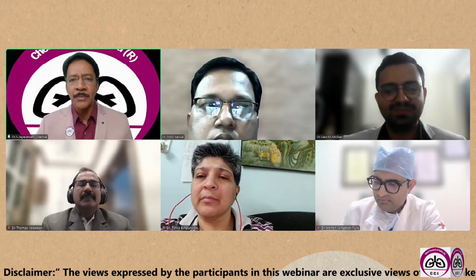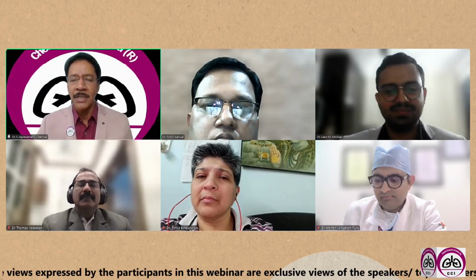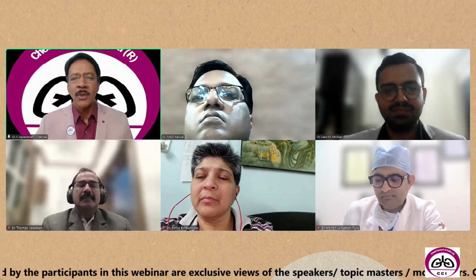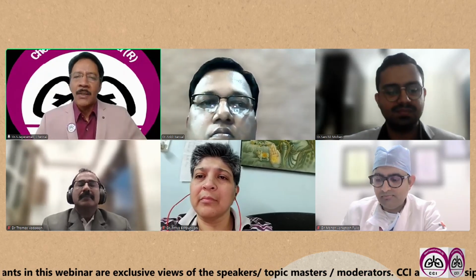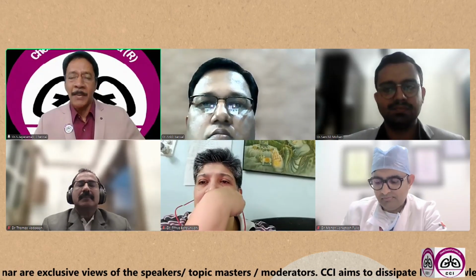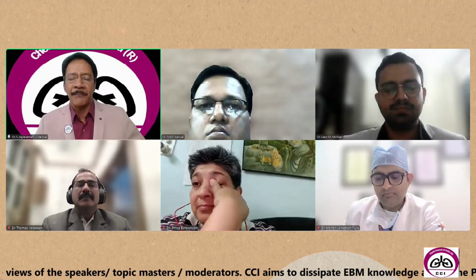And Dr. Mohan Venkateshpulli, a very nice presentation on the mediastinum through the surgeon's eye using mediastinoscopy. Yes, mediastinoscopy is a gold standard diagnostic tool to diagnose all kinds of mediastinal lesions. But with EBUS, we can't reach all the stations and all the areas in the mediastinum.